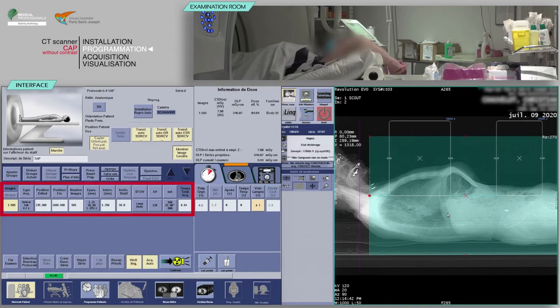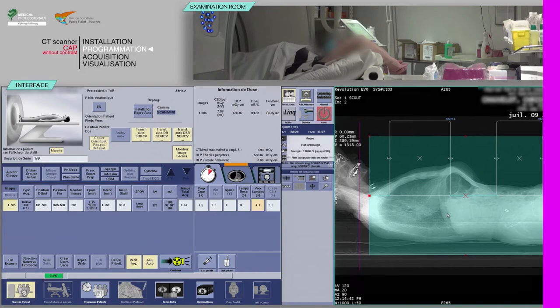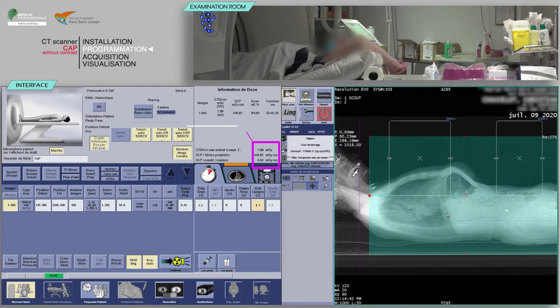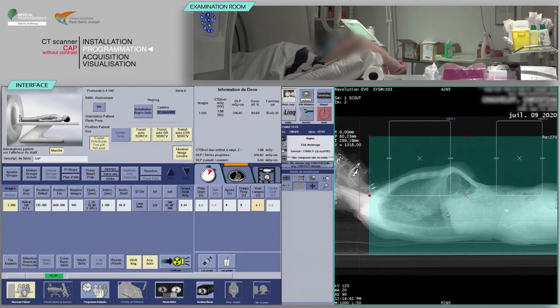Verify the consistency of acquisition parameters, which are often pre-configured. Before continuing, check the predicted dose is consistent with the diagnostic guideline values. Check the reconstruction ranges.